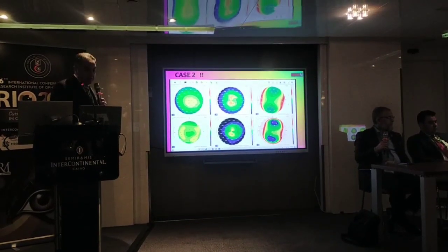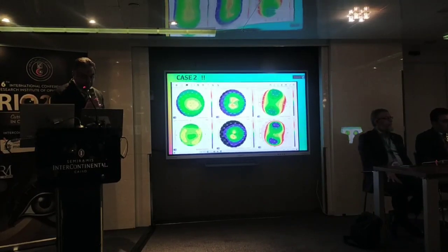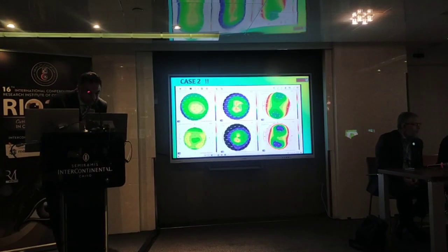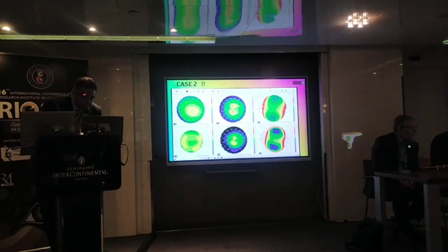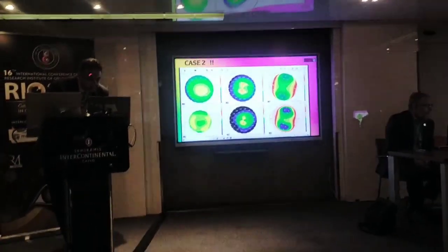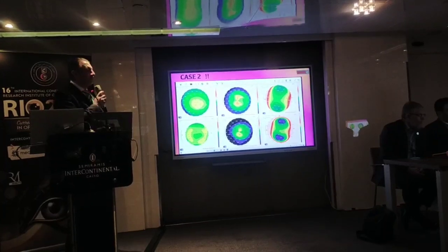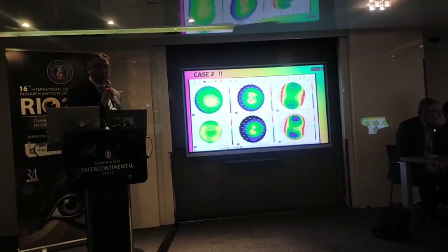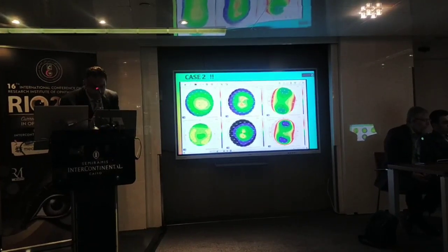Here is another case — a patient with inferior steepening. The superior-inferior point difference is 2.2, which is highly significant, especially in the central part of the cornea, and this could be highly suspicious for keratoconus.